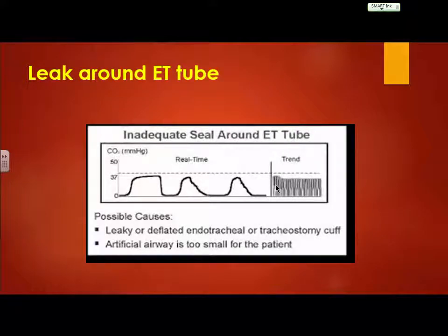So again, with equipment malfunction and stuff, if you're trucking along and nothing's really changed for your patient, and you start seeing these really weird waveforms, of course, check your patient first, but most likely you've got an equipment malfunction. Those sampling tubes, they're designed to withstand a little while, but they're not designed to withstand prolonged monitoring. I mean, we had to change ours in the ICU like every 6 hours, because they get clogged very easily, and those samplings don't work for a long time.